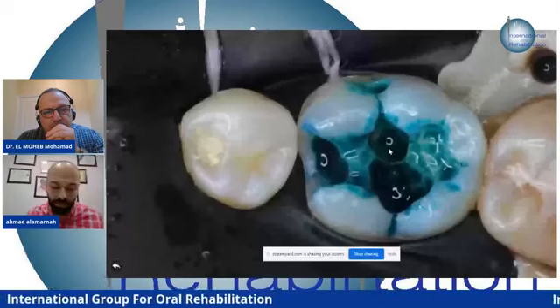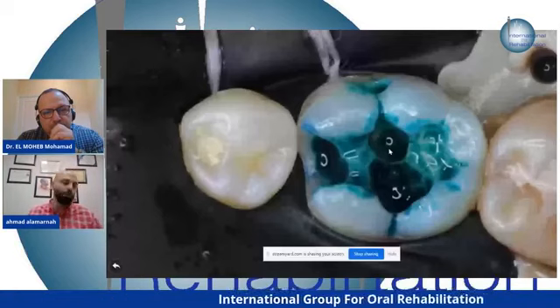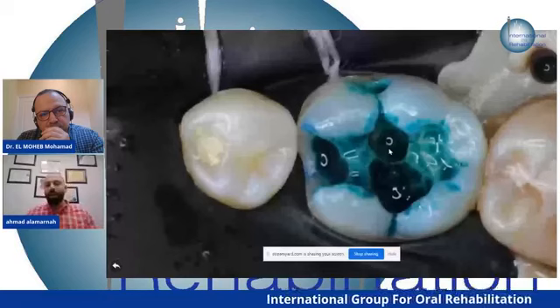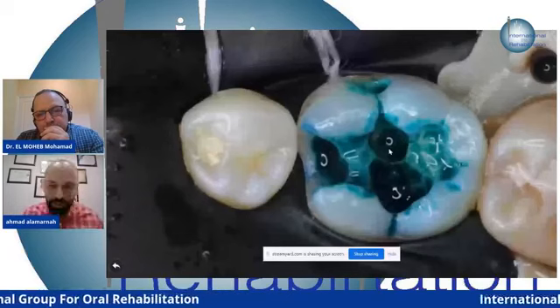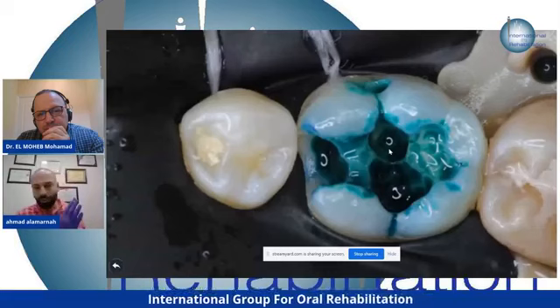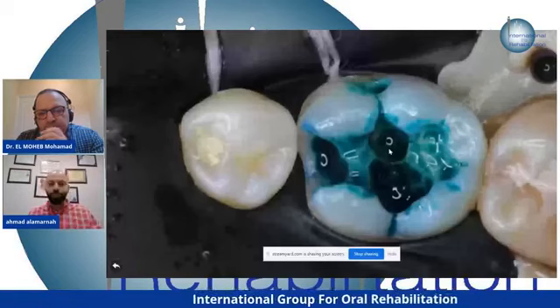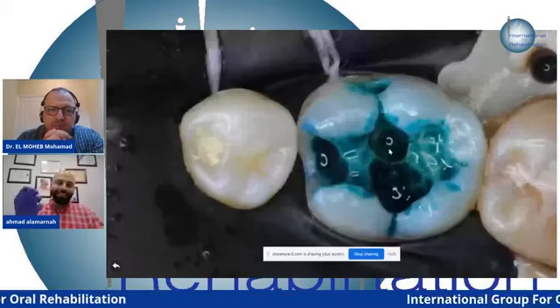Yeah, I do use the sodium hypochlorite and soak the cavity for like 10 or 20 seconds, and rub it to do some activation. Then I clean it with water and air, triple syringe. After I remove everything, I put my caries indicator, wait for 5 to 10 seconds, or read the factory recommendation, because every caries indicator has its own way to use it. Then water, and I see if there is a dark stain, it's caries.